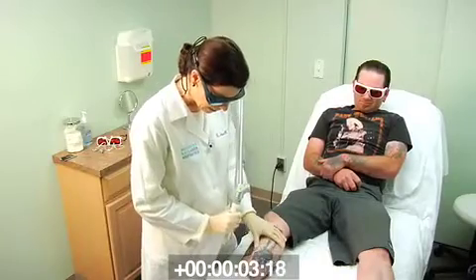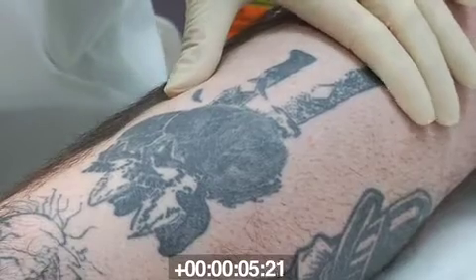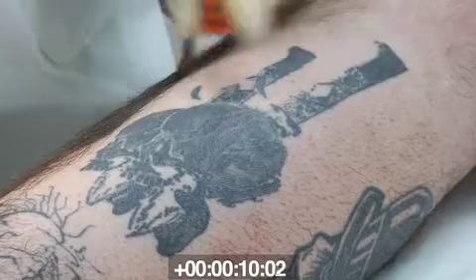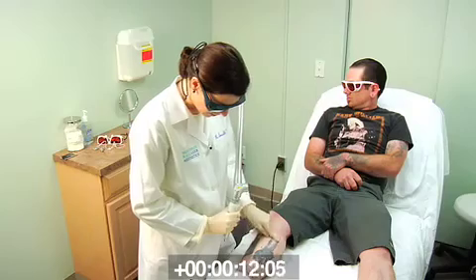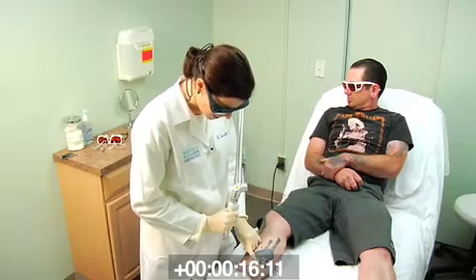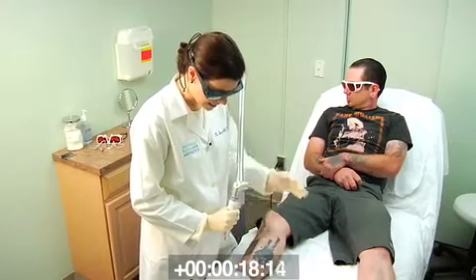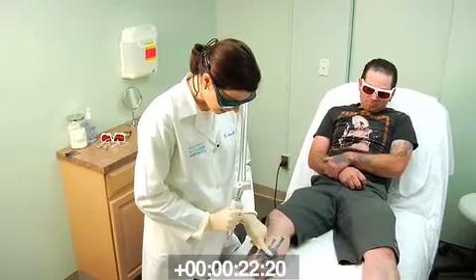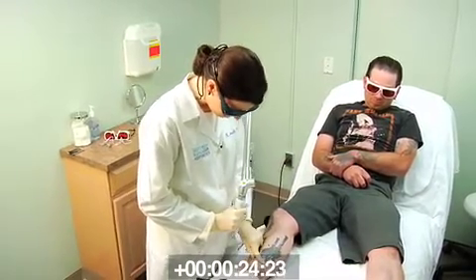So we're going to take a look at a black tattoo here. This patient has never had this tattoo treated, so this is the first treatment. The questions I've already asked this patient are whether or not this is a cover-up tattoo, i.e. is there a second tattoo over the first tattoo, and there is not. This has just been tattooed once.